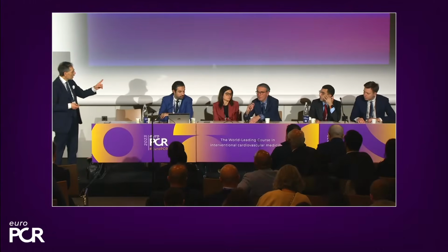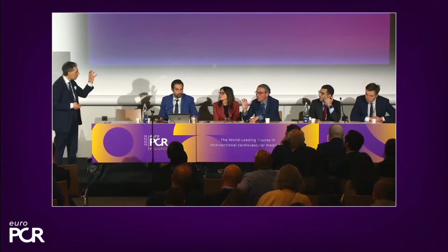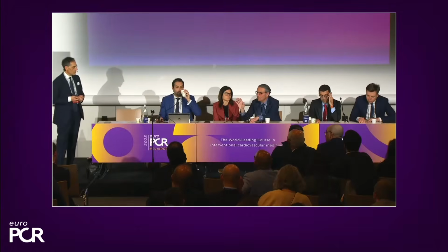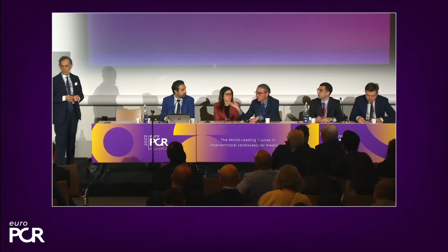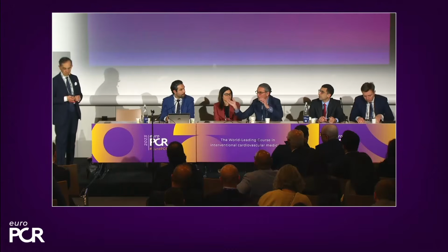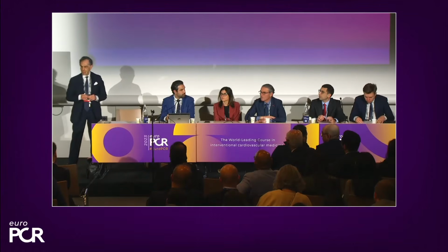No, absolutely not. And also one number, in terms of a percentage, we can figure out the increase of dosage: average 5%, between 5 to 10 maximum, and no burns on the skin because you are moving. So the incidence is moving, so no impact completely on the patient.